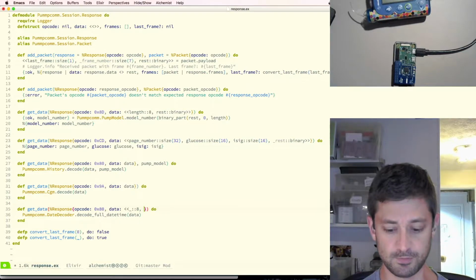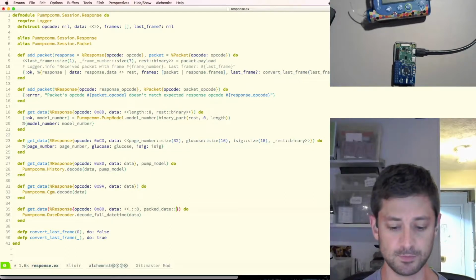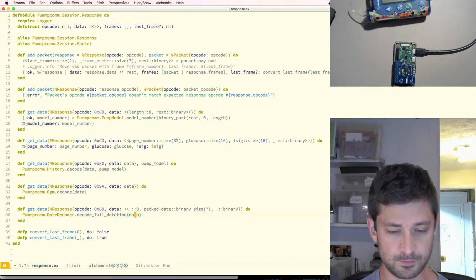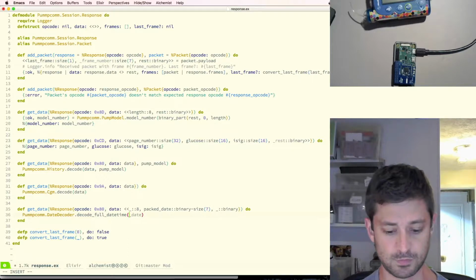I'll call it the packed date. I don't know, that seems silly, but 7 bytes of that, and then the rest we don't care about. I'll call it encoded. I think that sounds a little bit more like what's going on here.